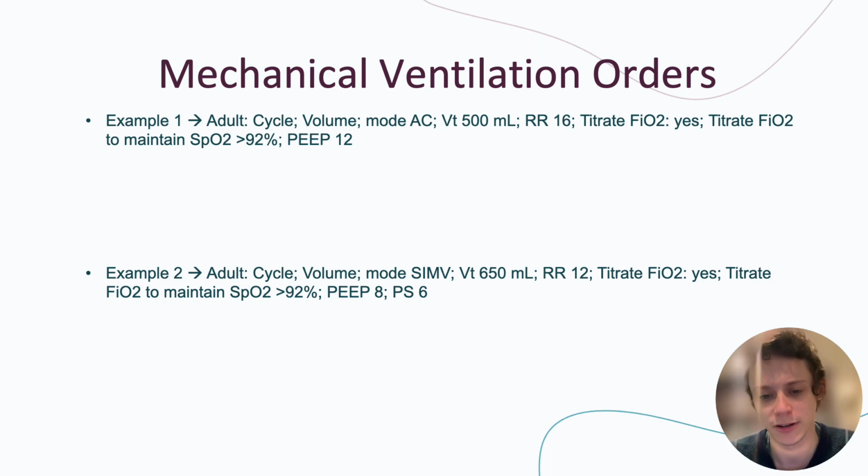So for the very last part of this topic discussion, I wanted to give some examples of what some mechanical ventilation orders might look like in EPIC. My hope is that with all the information given during this topic discussion, you should be able to decipher these medication or ventilation orders and get an idea of where the patient is at with their mechanical ventilation. So I have 2 fairly similar but also quite different examples.